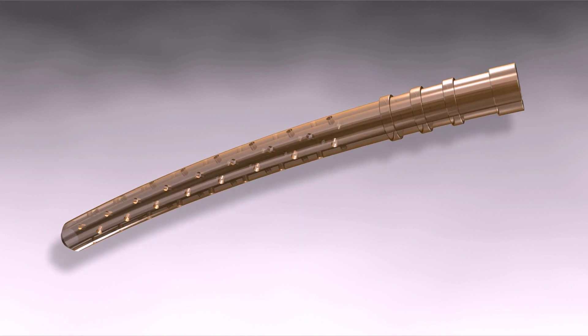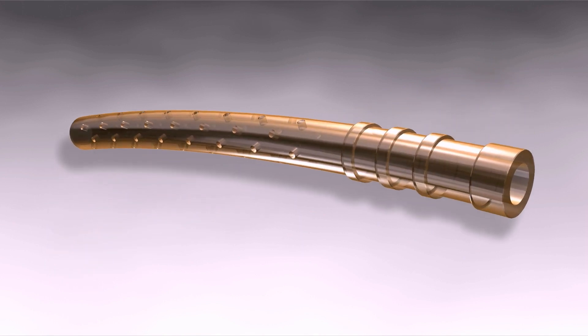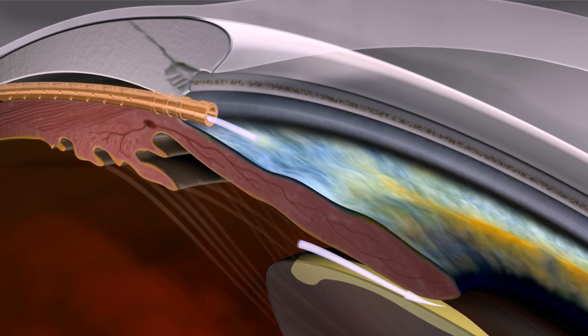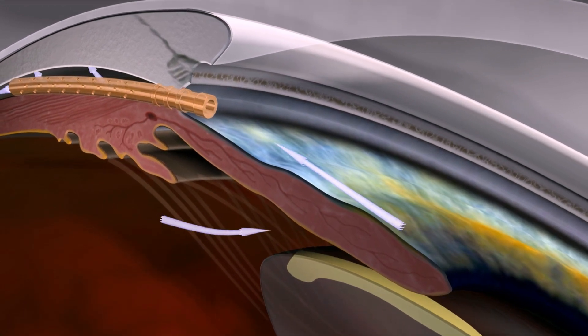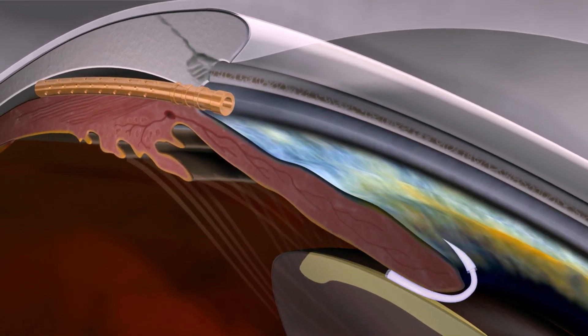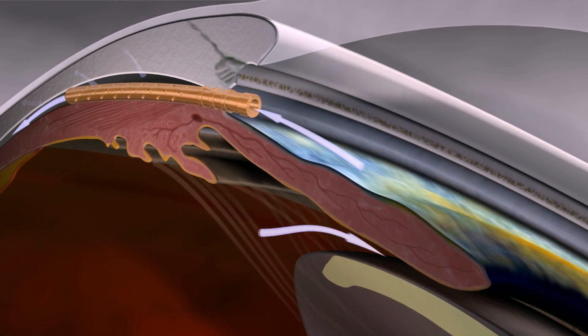The Cypass Microstent, an implantable device, is designed to reduce intraocular pressure by enhancing aqueous outflow to the suprachoroidal space in a minimally invasive ab-internal procedure.